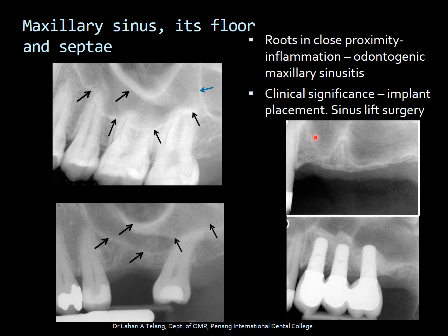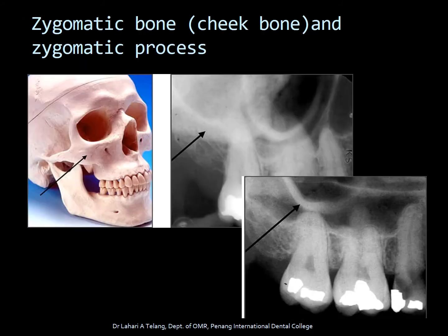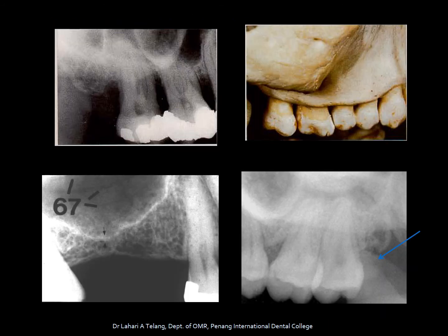It is important to lift up the sinus floor and make space for the implant — that surgery is called a sinus lift surgery. This radiograph shows how, in the same edentulous area, the sinus floor has been lifted and space has been made for an implant. The zygomatic bone is the cheekbone, visible as a radiopaque shadow on posterior maxillary radiographs, along with the U-shaped shadow of the zygomatic process. You can also see the floor of the maxillary sinus in an edentulous area dipping quite low.